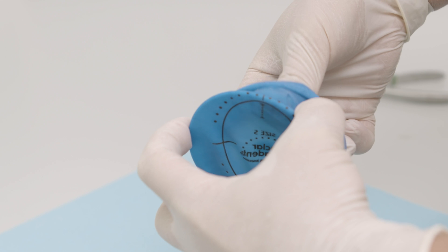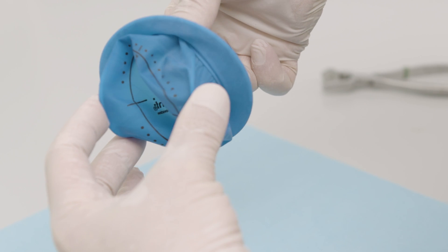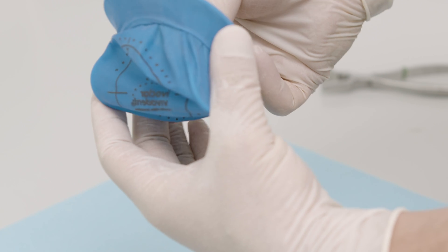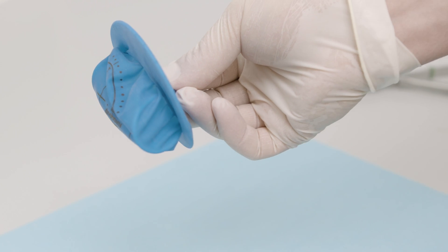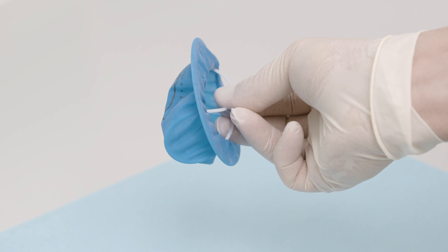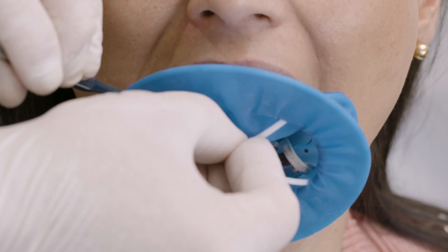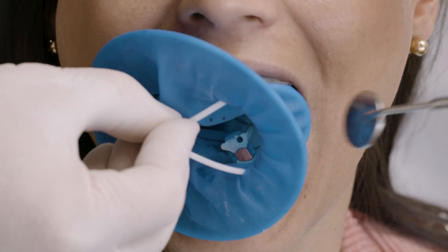To ease placement, grasp the flexible intraoral ring by reaching through the outer ring. Hold the intraoral ring between the thumb and middle finger and press it together slightly. Compress the inner ring so that wings form on both sides.